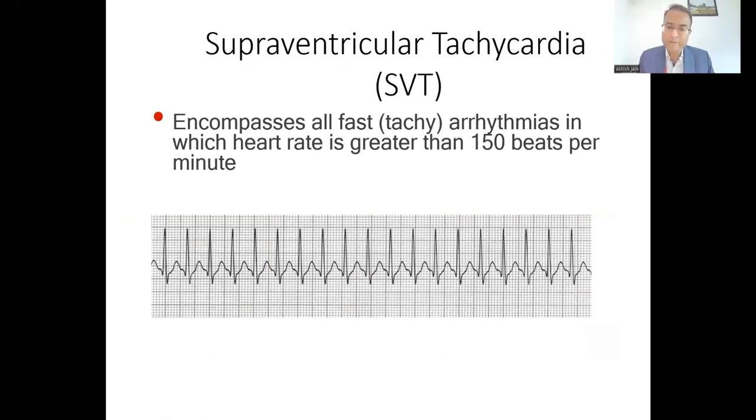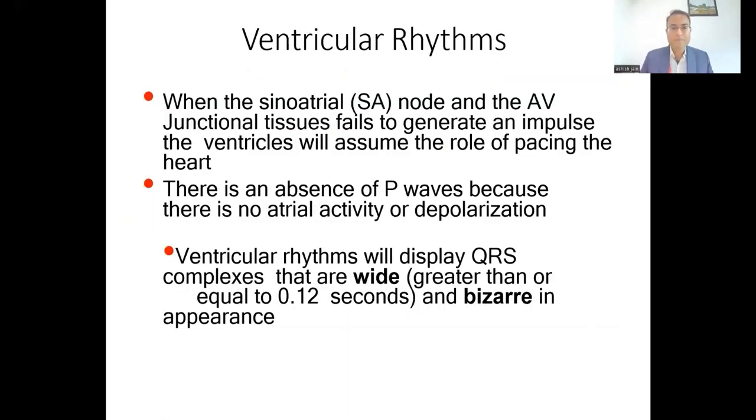Then the supraventricular tachycardia. In supraventricular tachycardia, the atrial rates and the ventricular rates are high, around 200 or 150. P waves are generally indistinguishable. We cannot identify them. The PR interval we cannot identify, but the QRS complex and QRS duration are normal.